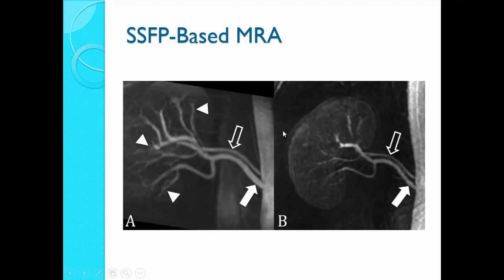The subtracted image is where you have subtracted all of the other areas, and you can see that the diameter of the vessel is larger compared to this one, because it has subtracted the vessel walls as well as the fats and other things that are aiding our imaging. So this particular technique is also used as an angiography.